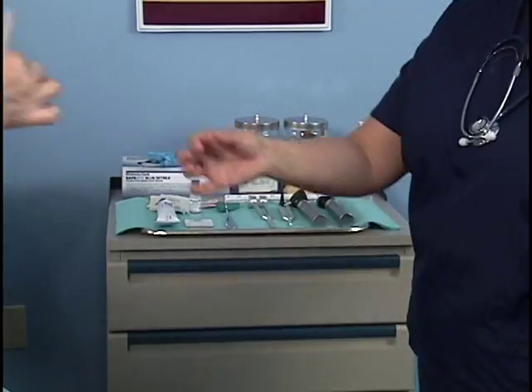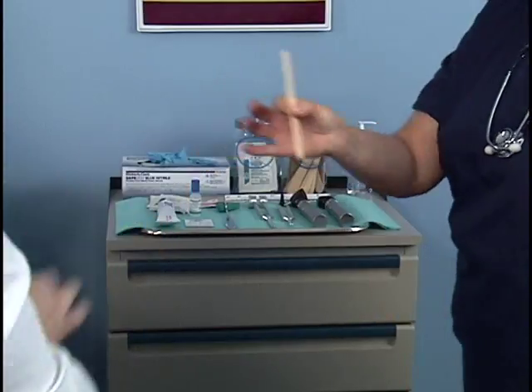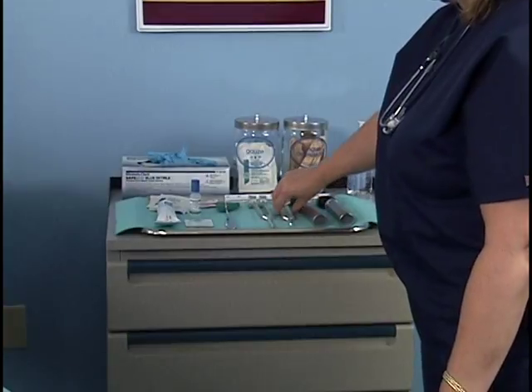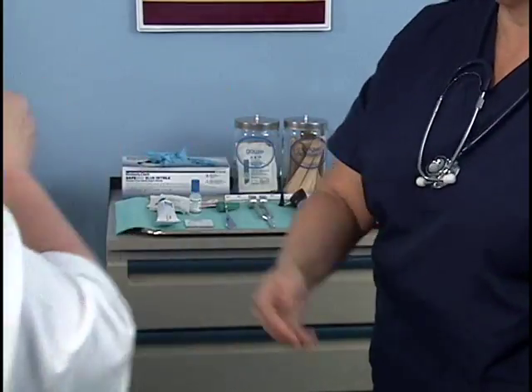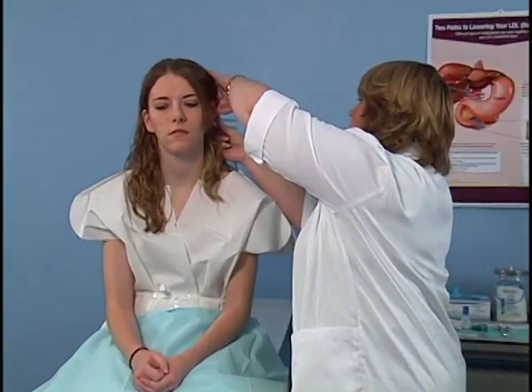The physician hands you the tongue depressor after it is used. Transfer it by holding it at the center to prevent contact with the patient's secretions, which may contain pathogens. Dispose of the tongue depressor in a regular waste container. Hearing acuity is tested using a tuning fork. Hand the tuning fork to the physician when she is ready to test the patient's hearing acuity.